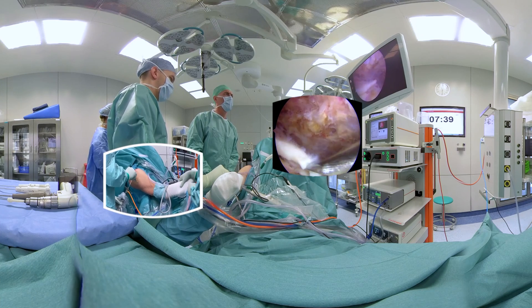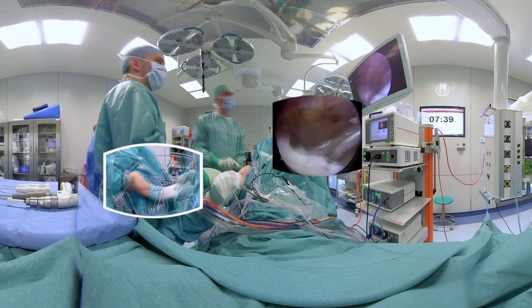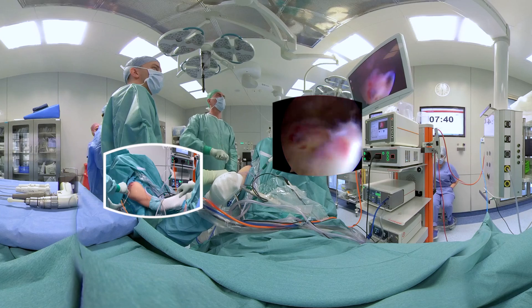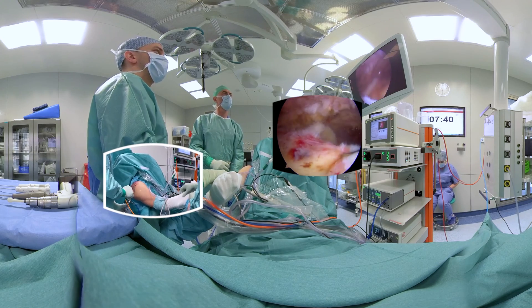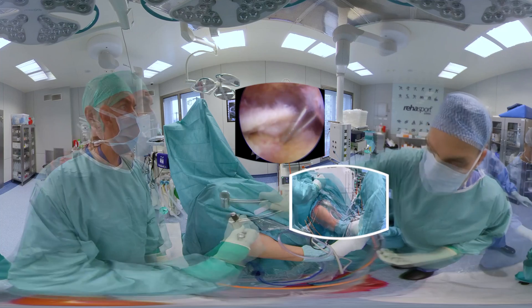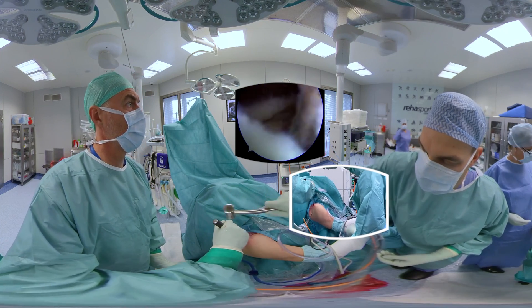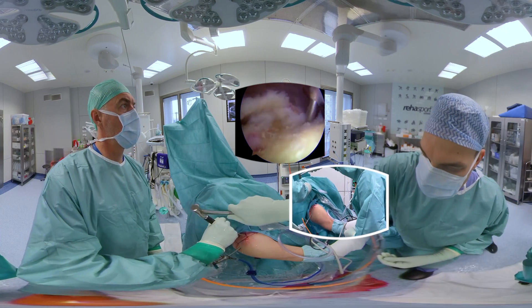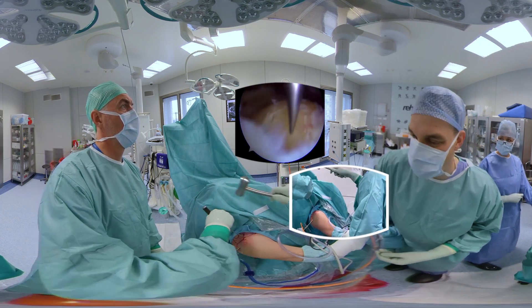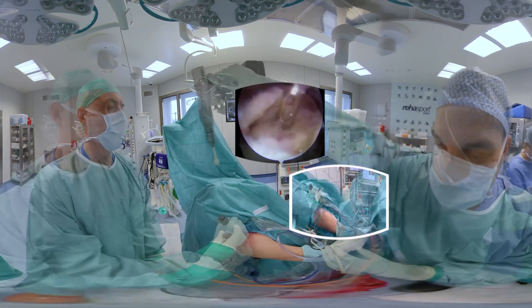The frayed edges of the tendon are removed. We need to assess tendon mobility and reduction to the footprint. Next, the footprint is prepared with microfractures to stimulate bone marrow and possibly enhance tendon-to-bone healing. We will repair the supraspinatus with a double row cross-bridge technique.